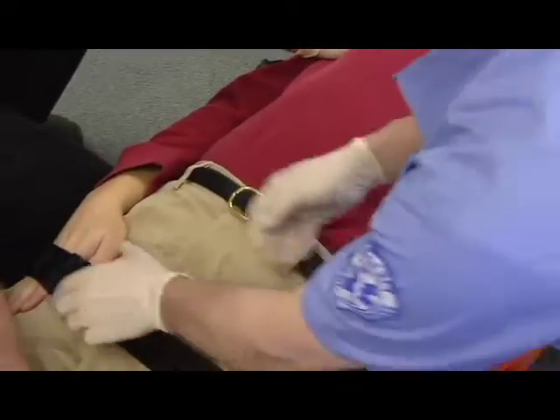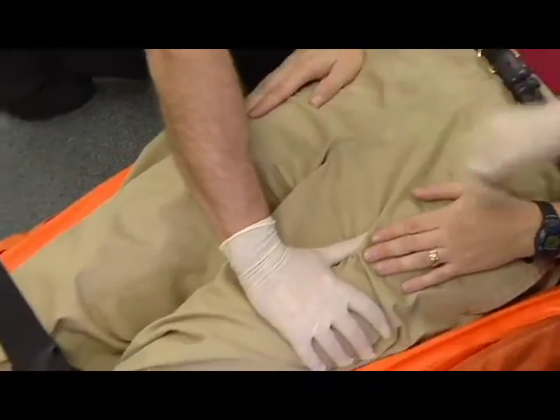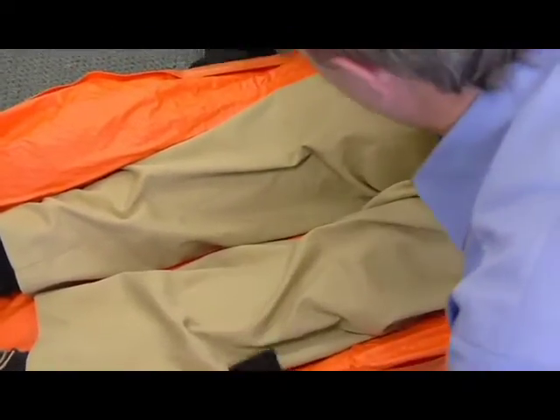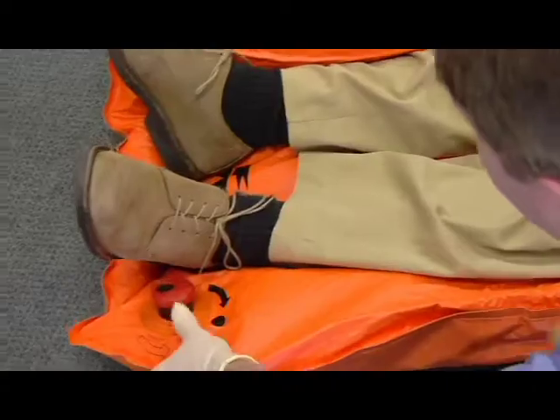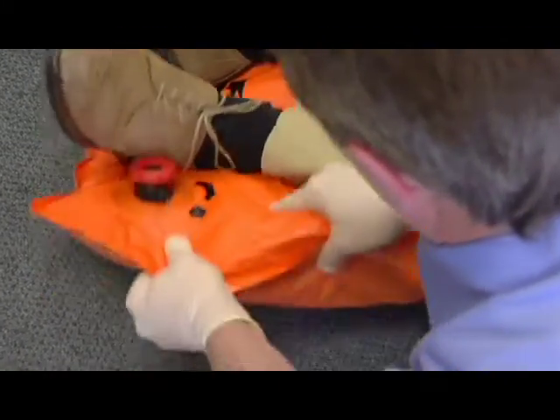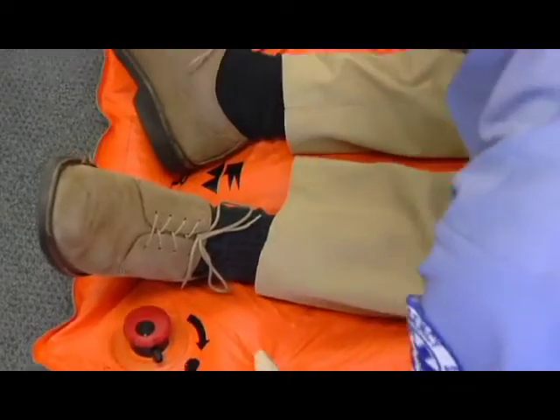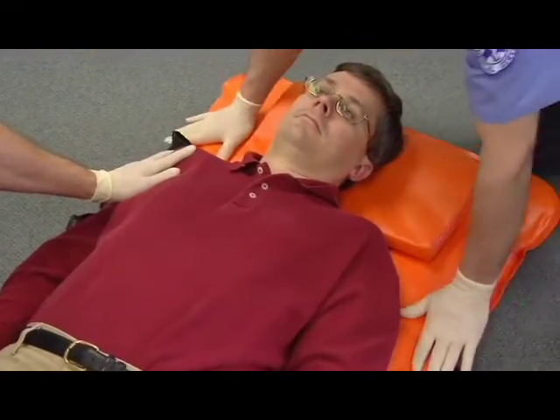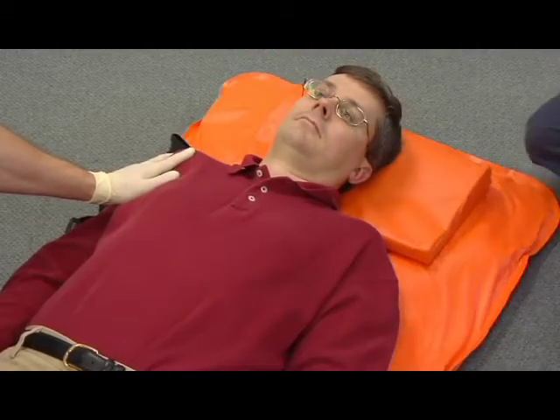To remove a patient from the mattress, manually stabilize the patient throughout the procedure. Unfasten the restraints. Open the valve to allow air into the mattress so the mattress will become pliable and no longer hug the patient's body. When the mattress is as pliable as desired, transfer the patient from the mattress using local protocols.